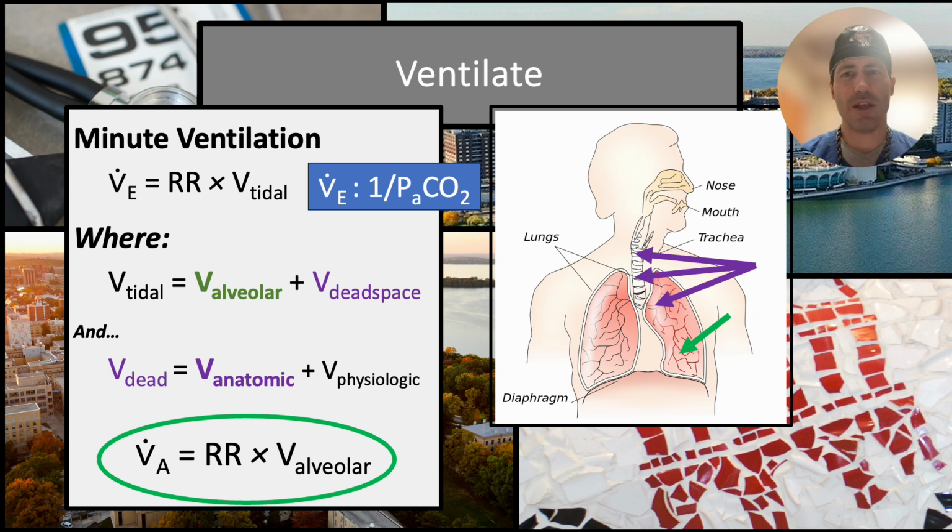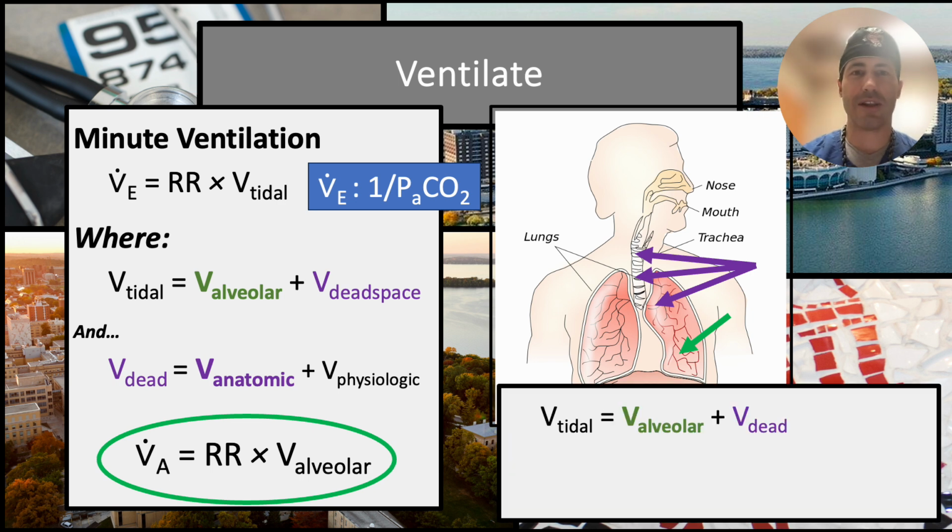The very important thing to remember as you get patients that are sicker with lung disease is that what actually does CO2 exchange, so how you actually breathe out CO2, is alveolar minute ventilation. Alveolar minute ventilation is the respiratory rate times the tidal volume minus that dead space, or your alveolar ventilation, the tidal volume that actually gets to the alveolus and does its work there. The reason this is relevant is that we use fairly small tidal volumes in modern practice.